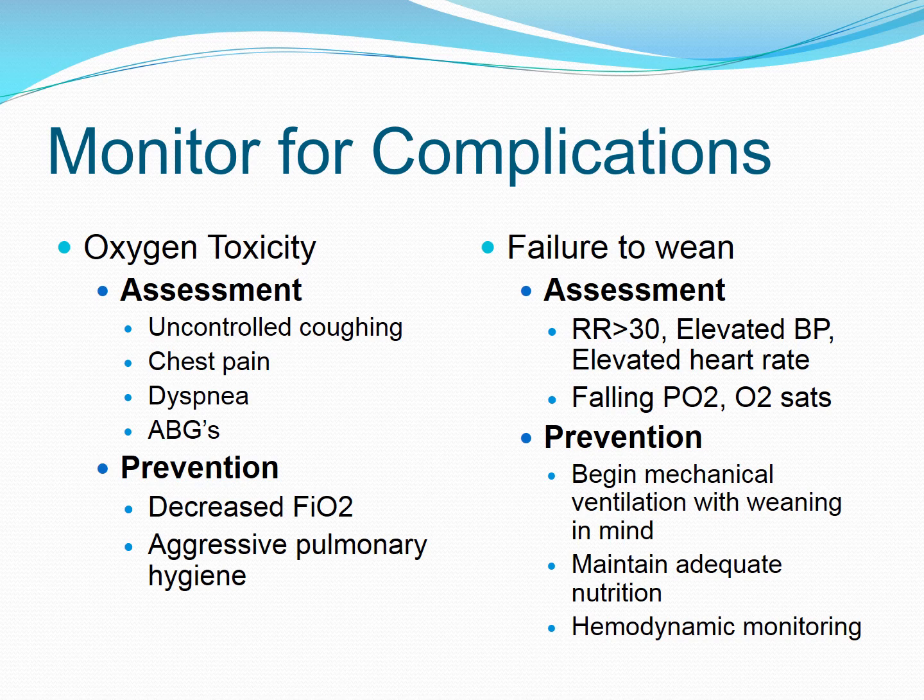So we also have to think about failure to wean. One of the other things that we do want to do is we want to get the patient off this ventilator. So when we try to get this patient off the ventilator using the SIMV mode, maybe pressure support mode, or doing CPAP trials, you want to assess your patient.